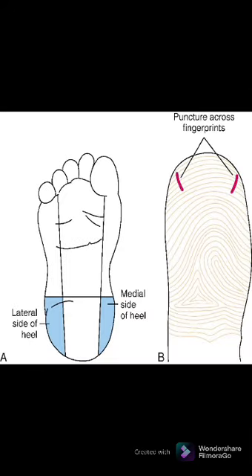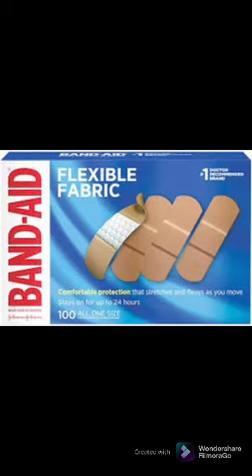Then puncture site and discard the lancet. Wipe away the first drop of blood. Then fill and mix tubes in order of draw. Place gauze and apply pressure. Label specimen and observe special handling instructions. Check the site to see if it stopped bleeding and apply bandage.